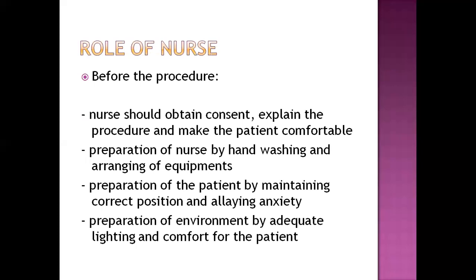Next part is role of nurse. There is role of nurse during the procedure, but we can divide it into before the procedure and after the procedure. Before the procedure, first of all, nurse should obtain consent, both in written and verbal form, and explain the procedure, explaining each step so that the patient can feel comfortable. Next, nurse should prepare herself by washing hands and arranging all the equipment on time, even before the patient arrives.